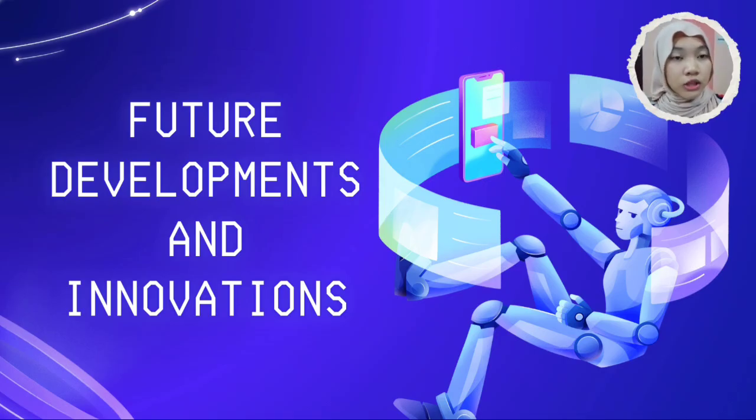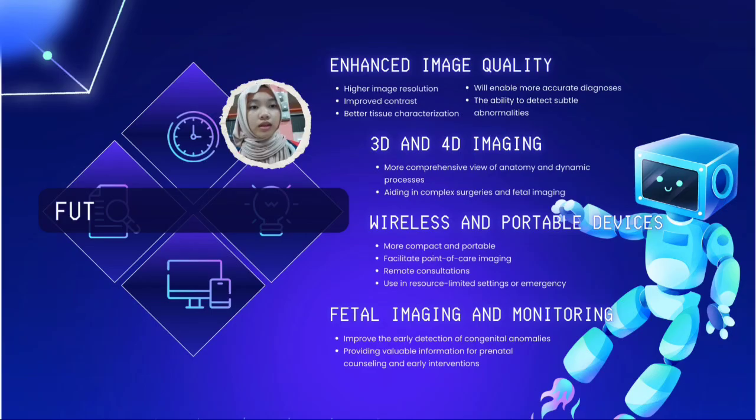Let's dive into the future development and innovation of ultrasound. In my research, I've found a lot of points that I can point out, but I choose 4 points, which is enhanced image quality. Advancement in ultrasound transducer design and signal processing techniques will lead to higher image resolution, improved contrast, and better tissue characterization. This will enable more accurate diagnosis and the ability to detect subtle abnormalities.